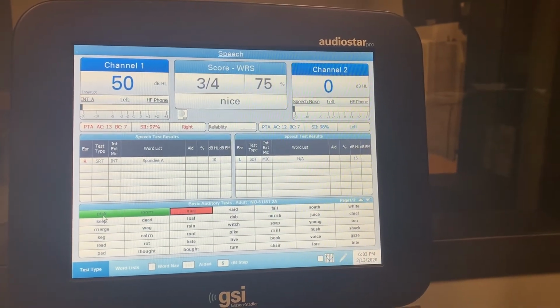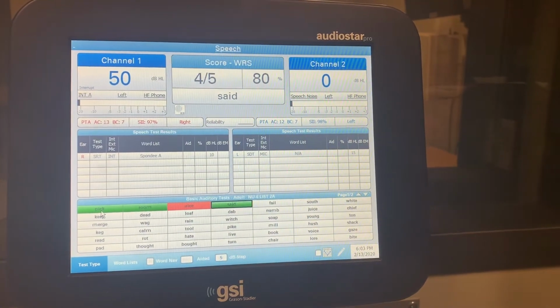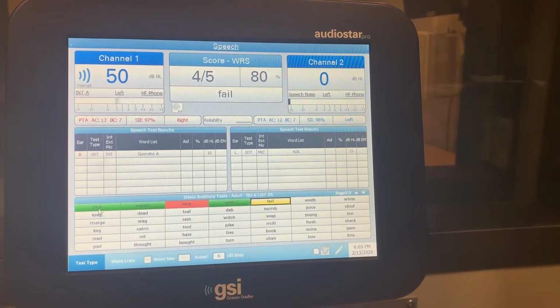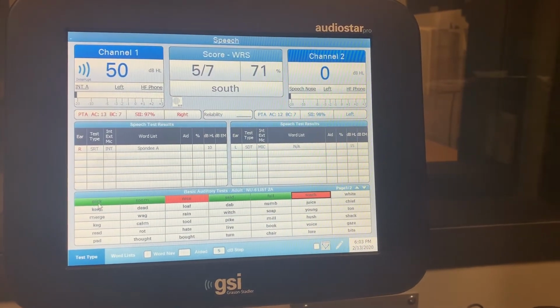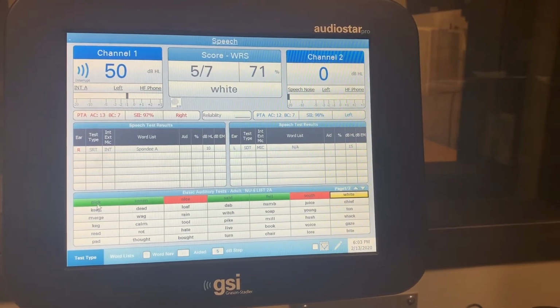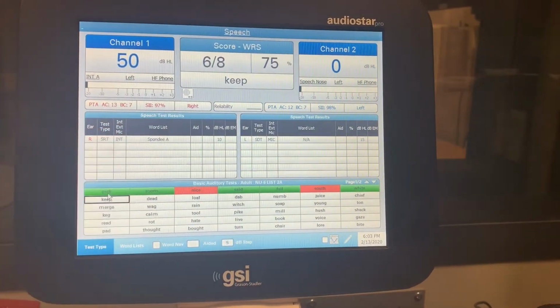So we can go back in and correct that later, as long as you keep track of what they actually got correct and didn't. So we'll just do these top 7 for the purpose of the video. And we're going to pretend that they got 2 wrong out of 7. But we know that now it's keeping track of 8 instead of 7.